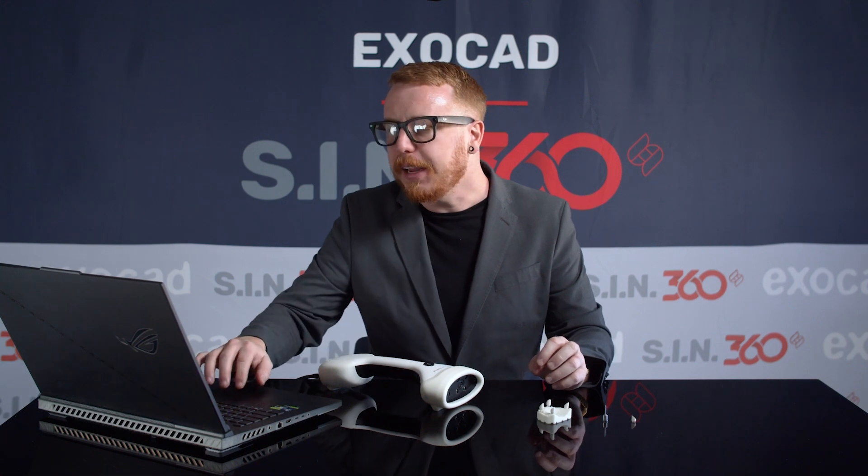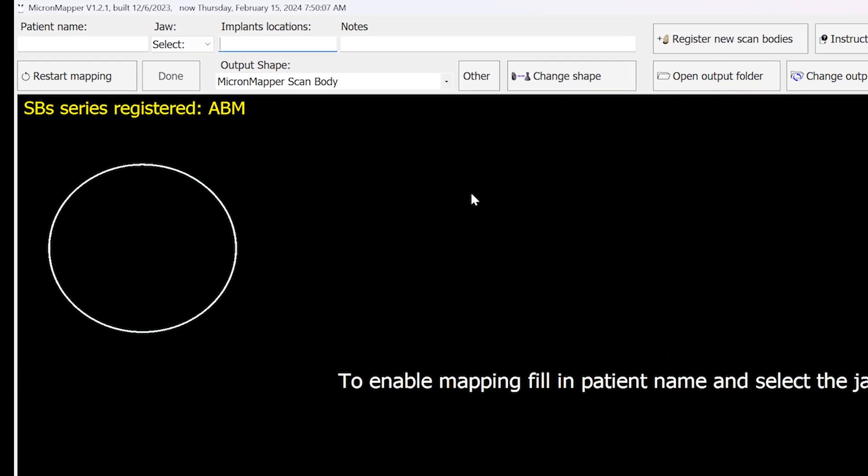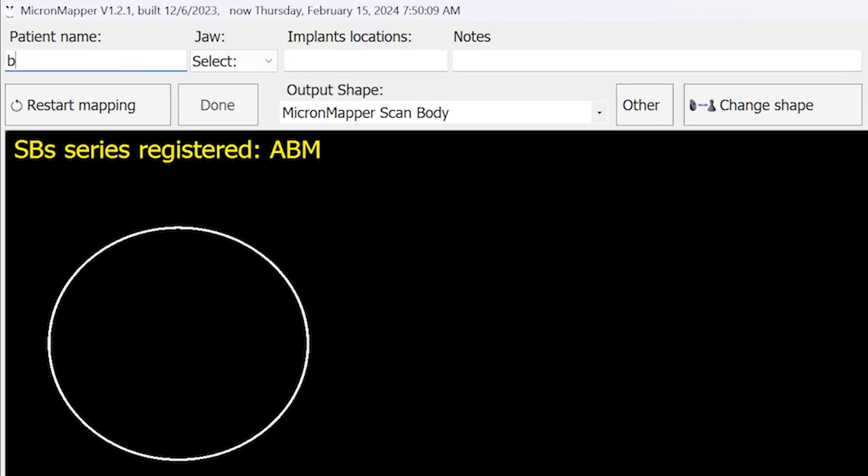We will begin by entering the patient's name into the software. Next, we will select the jaw, and we're going to type the total number of implant locations into the software.